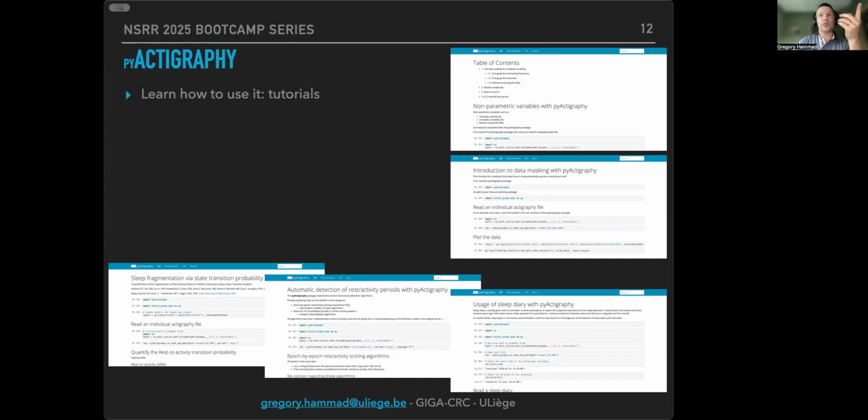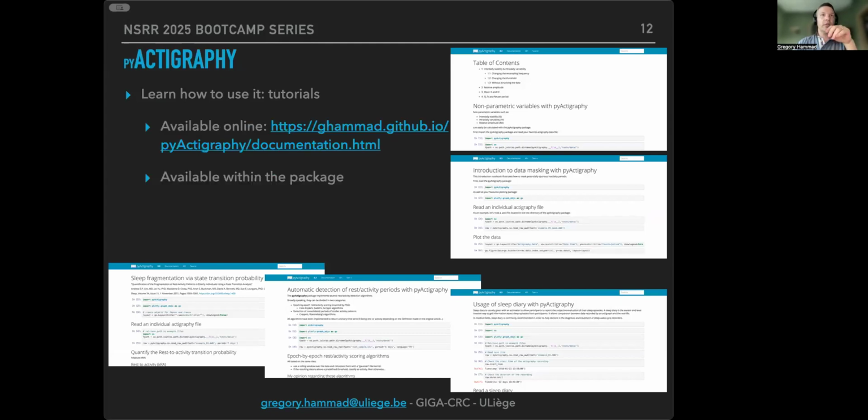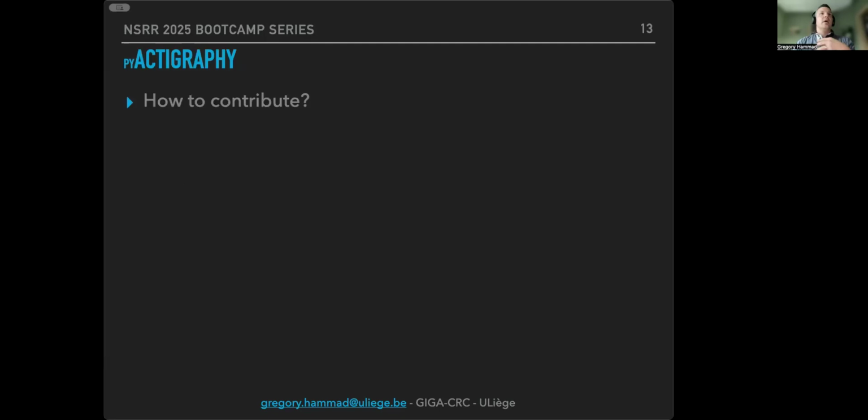Now, the tutorials, we will cover some of them. There are more than what we cover today, and they are online if you just want to see them. But if you want to practice them, you can just download the corresponding notebooks and run them yourself. Here is the link to the online documentation, and they are also available within the package if you download the package.